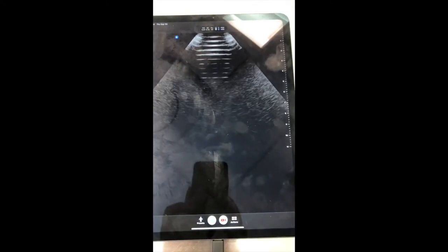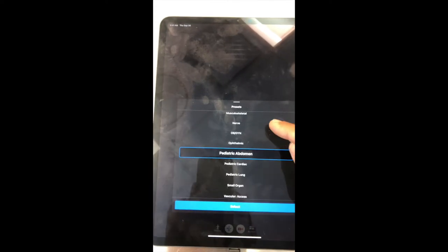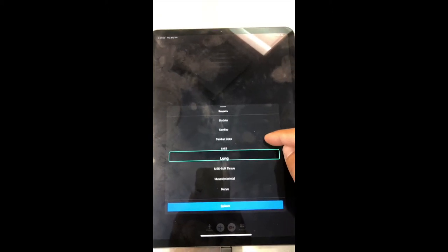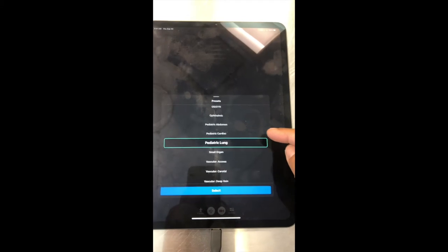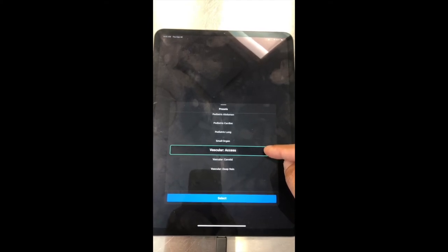By navigating the menu, you have another arrow button where you can see your previous archives and the Academy, and you can choose to go back to your ultrasound probe. On the ultrasound probe in the preset menu, you can choose which preset you are interested in. Today we will be looking at the presets of Pediatric Abdomen, Pediatric Cardiac, and Pediatric Lung, as these are the most relevant presets for the organs of interest. You can also use the vascular access preset if needed.